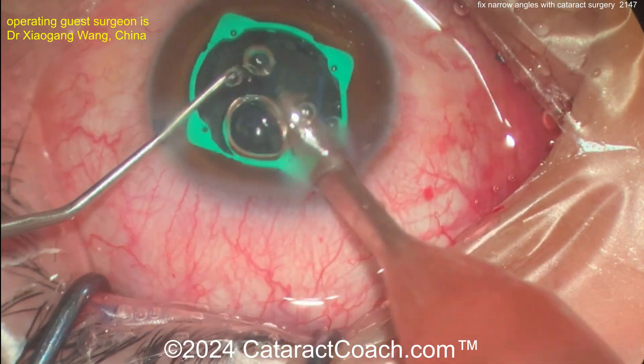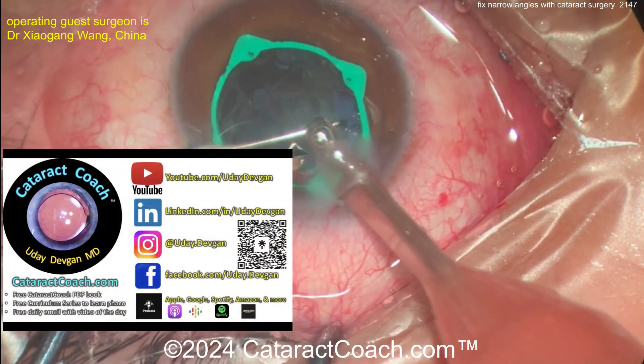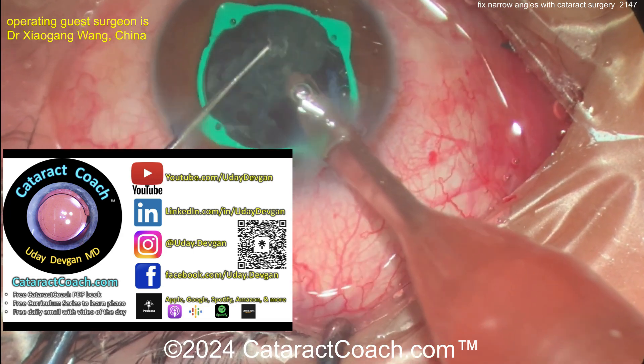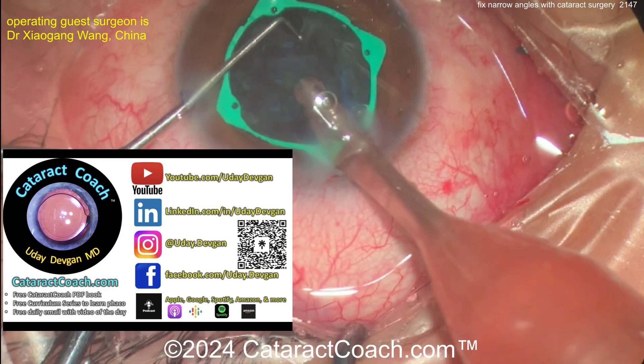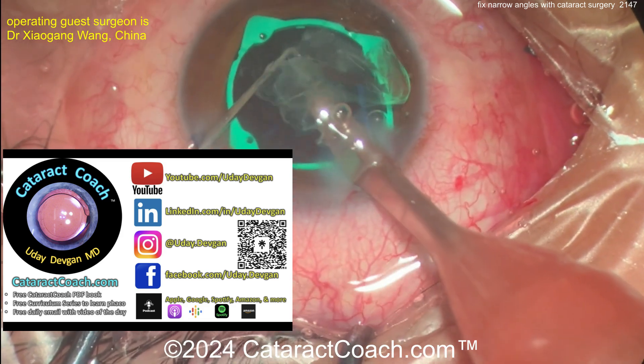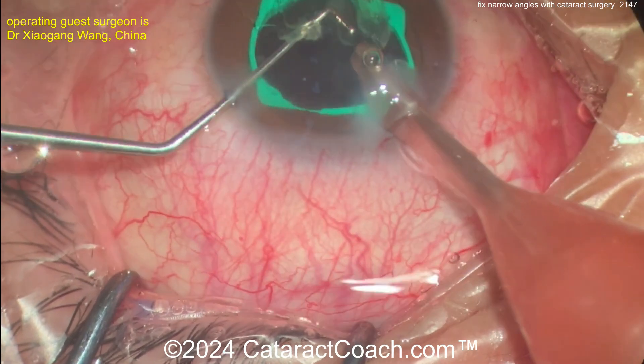Here we go, finishing up this case — the surgeon is doing a good job removing the nucleus. Check out cataractcoach.com for teaching materials and our weekly podcast. Back to the case — there's the last of the nucleus coming out pretty easily.